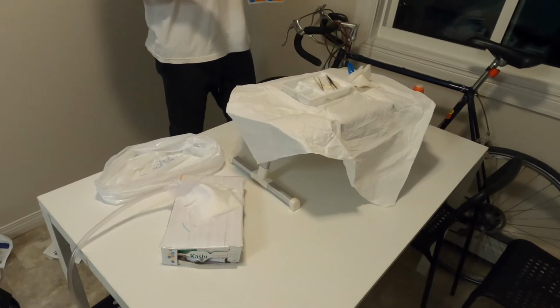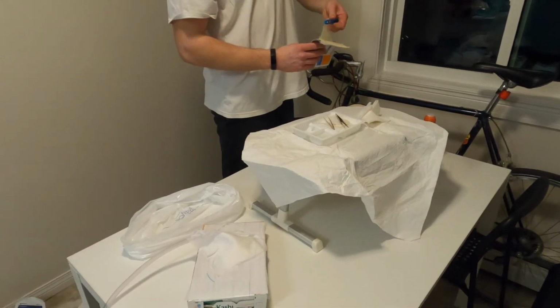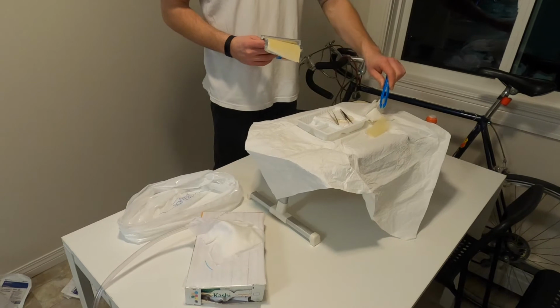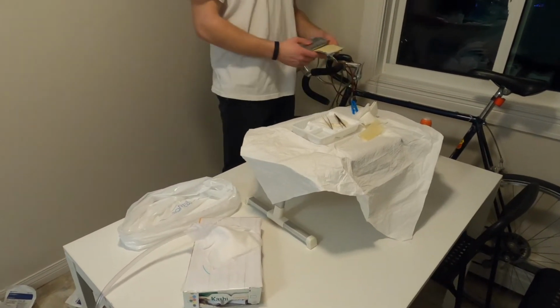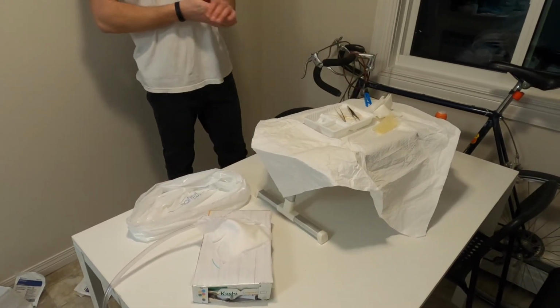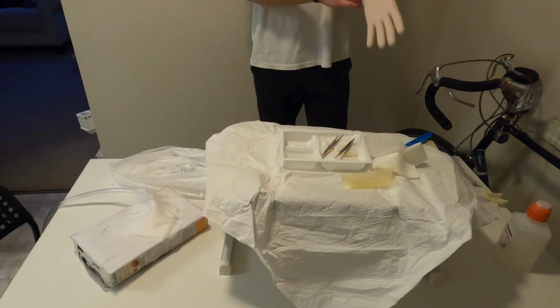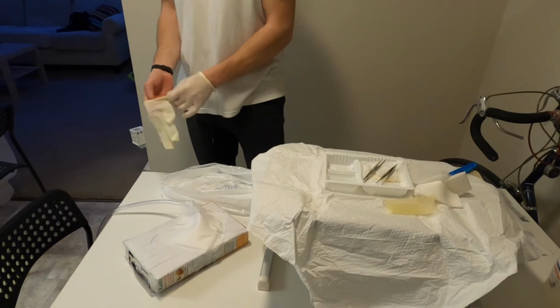I've been reusing materials while doing this demo, so the Gelinet is outside of its little kind of casing inside the package here. So I'm just gonna put this down like so. In practice, it would be in this casing here, but for the sake of the demo, it isn't. So now I can go ahead and wash my hands. I'm going to put some clean gloves on here. So some clean gloves, and I'm going to start to take the old dressing off.